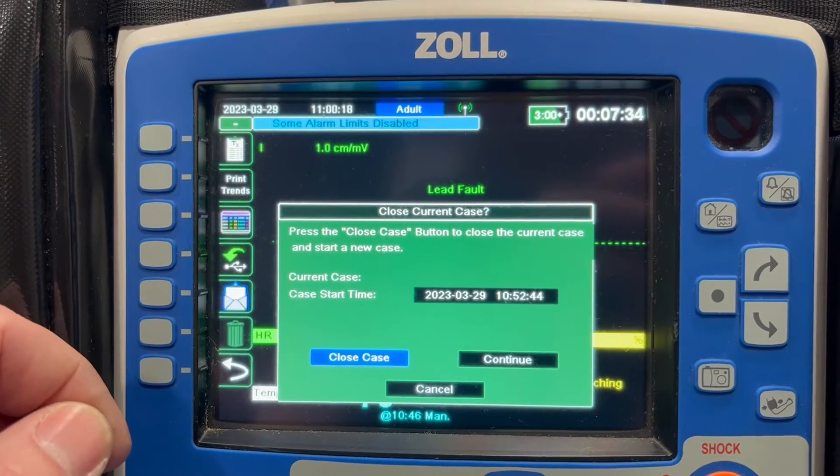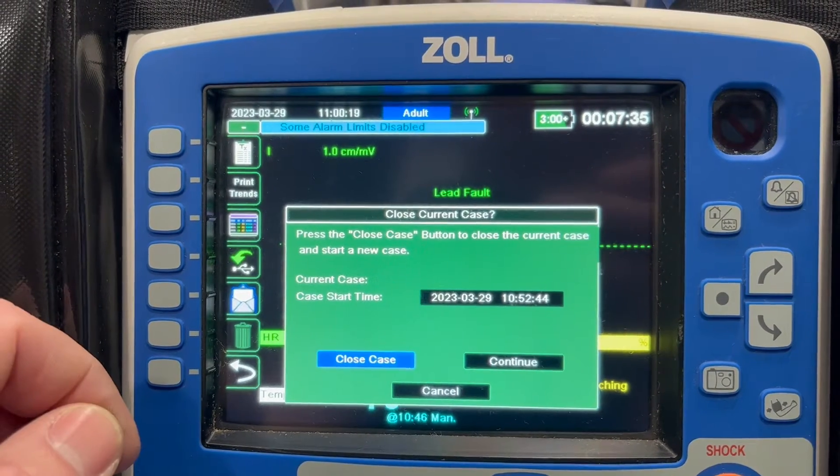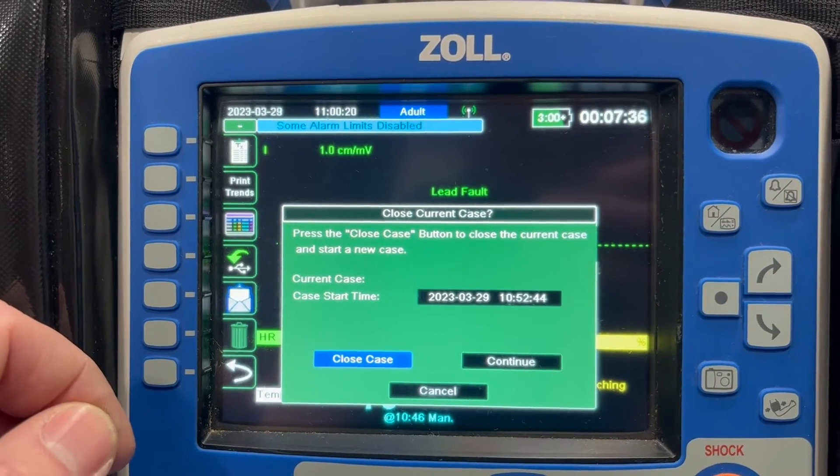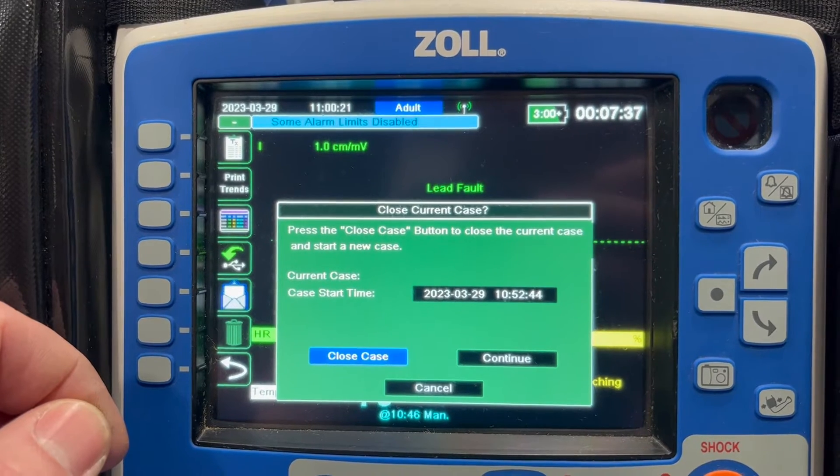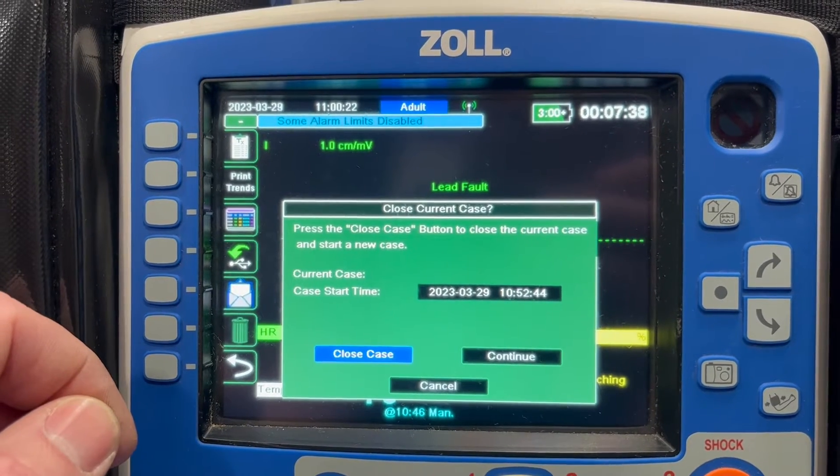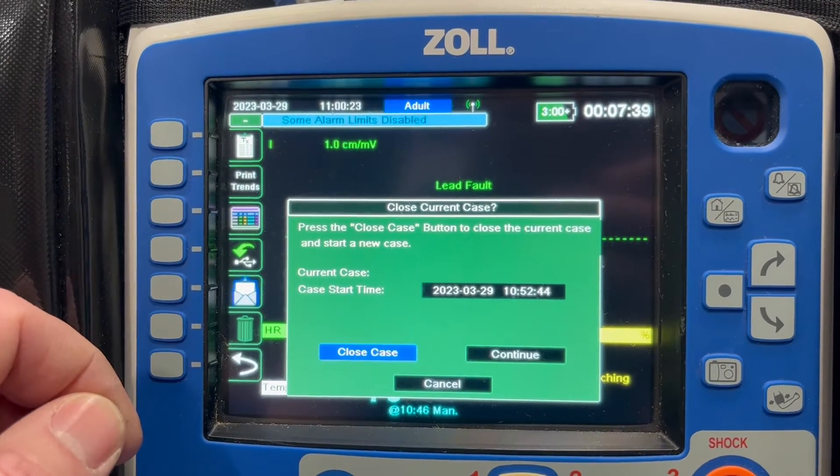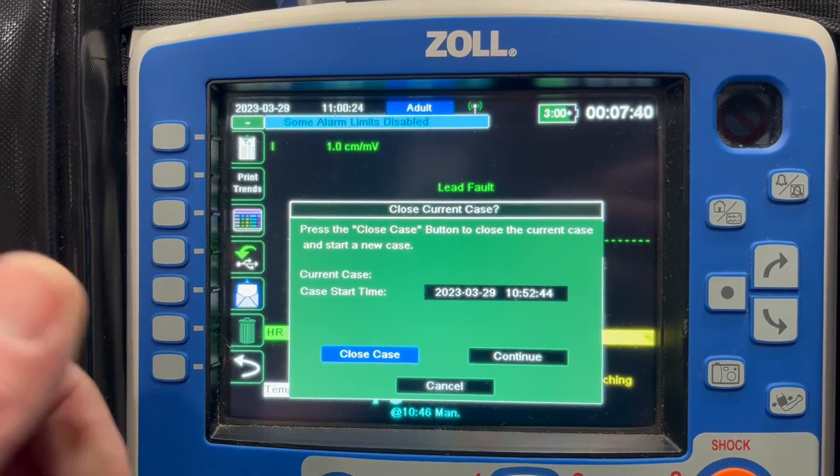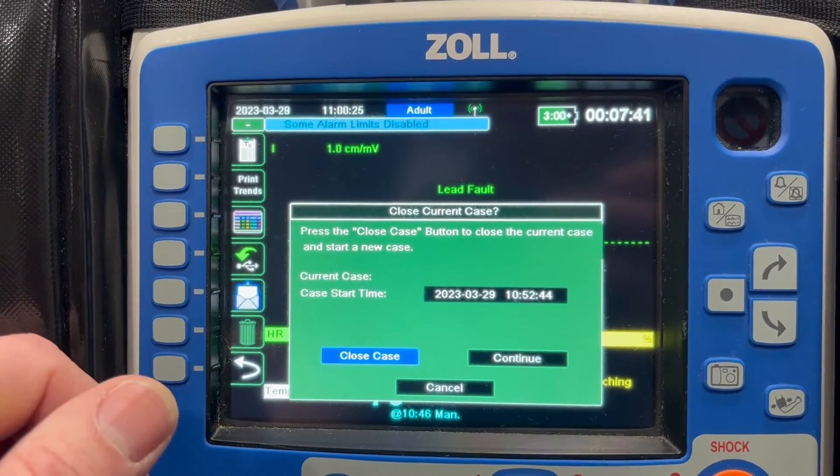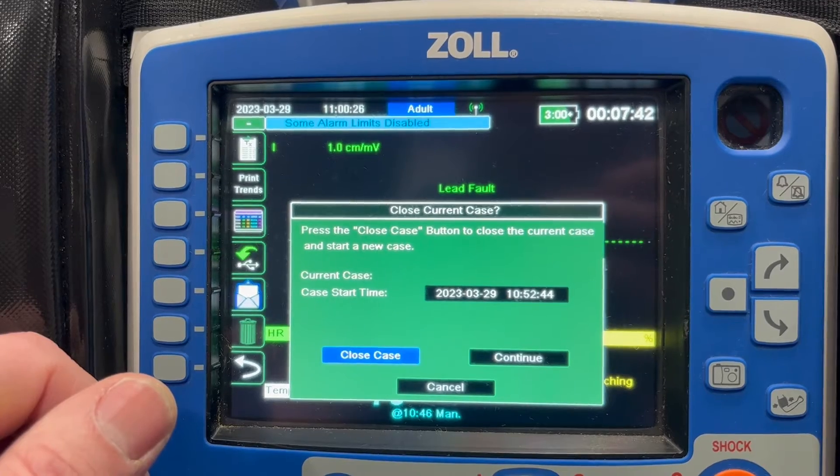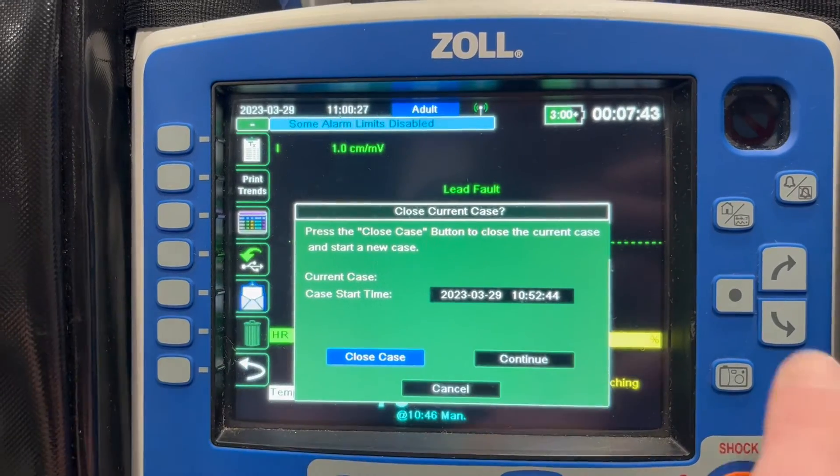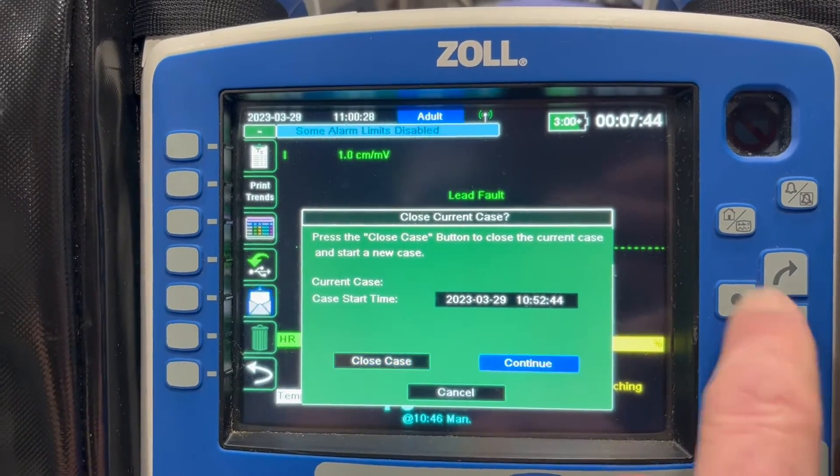So if you're done treating a patient, you're about to hand them over to the hospital and you want to get a jump start on your report, you can hit close case. If you're uploading a call that was done 20 minutes ago and you turn the monitor on, you can go to continue.